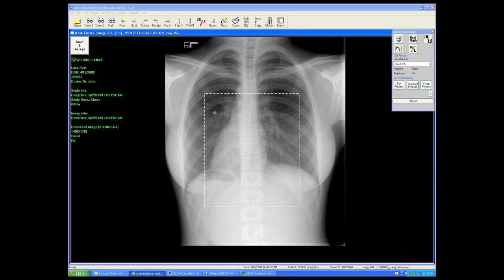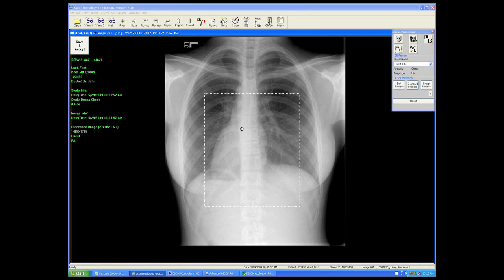The smart box looks at the darks, the grays, and the lighter areas that are contained within the box, and averages the brightness and contrast of those areas together to formulate a final window and level for the entire image. So if we change the size or the placement of the smart box, we will change the window and level, as in this example.